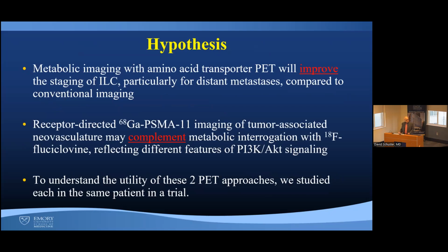So our hypothesis was that metabolic imaging with amino acid transport PET will improve the staging of ILC, particularly for distant mets compared to conventional imaging, and that receptor-directed PSMA imaging of tumor-associated neovasculature may complement this metabolic interrogation, reflecting perhaps different features of PI3K, AKT signaling.